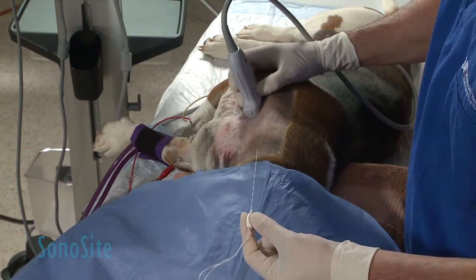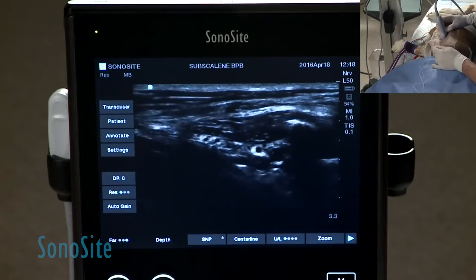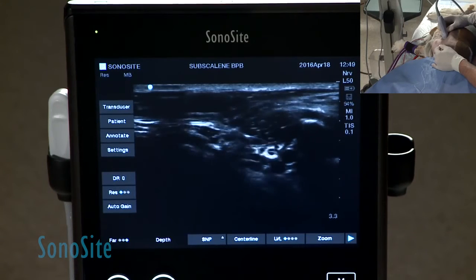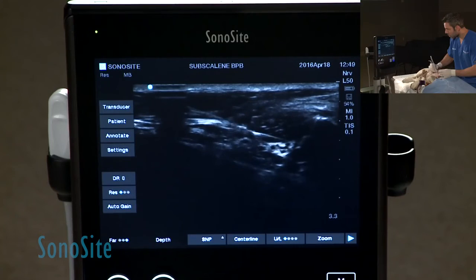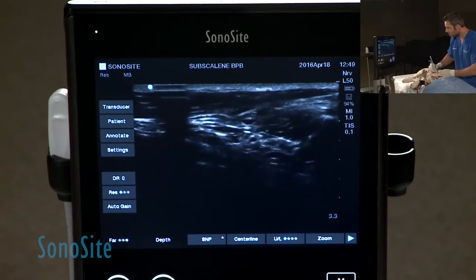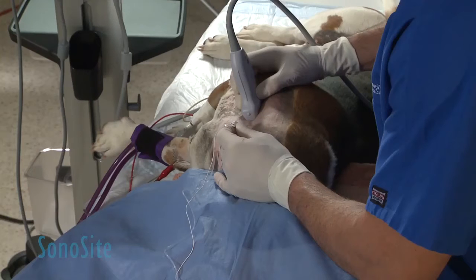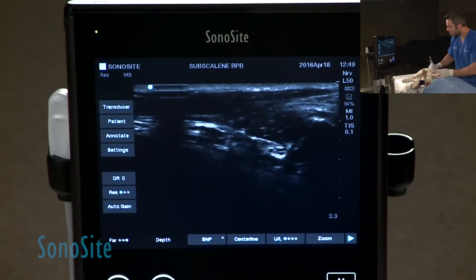The hypoechoic dots are your roots. For the first injection, I'm going to come pretty superficial, close to my probe. Once I visualize my needle, I move it to the most distal portion — you can see the limbs start moving. We're getting probably some ulnar and median nerve because I'm really low on the brachial plexus. After I inject here, I'm going to move a little bit cranial, and you can see the contraction of the limb will change because now I'm targeting a different root and different nerves.